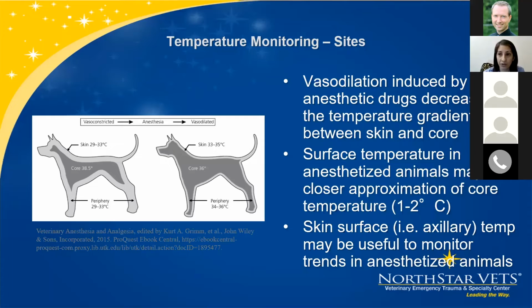This may be a useful thing to use as things progress, or if there is not the possibility of putting an esophageal probe or a rectal probe down to obtain a core body temperature.